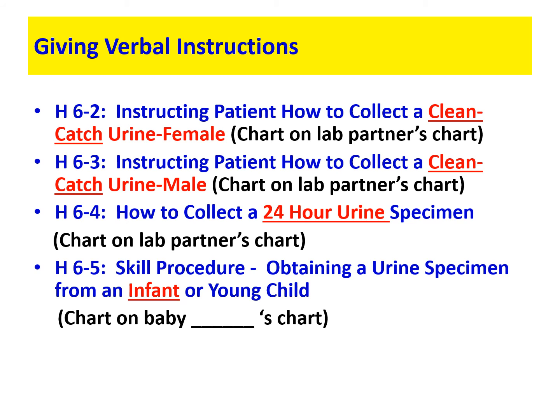We see a requisition form with Jane Doe's name and information on it. We see our doctor ordered a urinalysis, right? And then we all know that the first thing we're going to do is wash our hands and select our appropriate PPE for whatever we're doing with our patients, right? We're always going to make sure any area that we're working has been cleaned. Okay, we're always going to make sure that our area is stocked and organized and maintained so we can have all the supplies we need at our fingertips, right?